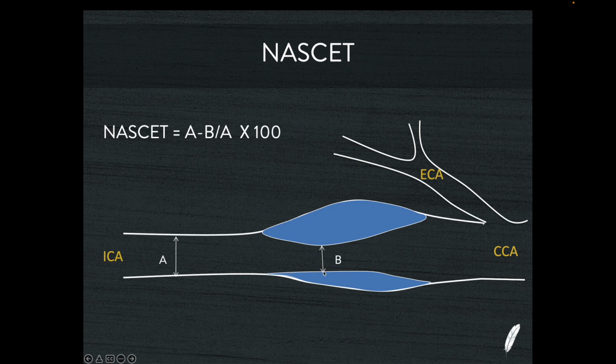we know when we do an ultrasound that when we see that being the case, we may have a significant buildup of soft plaque here that goes unvisualized and unreported on the angiography, but is very obvious on the ultrasound. And this can really change the way that we think about the patient and their management.